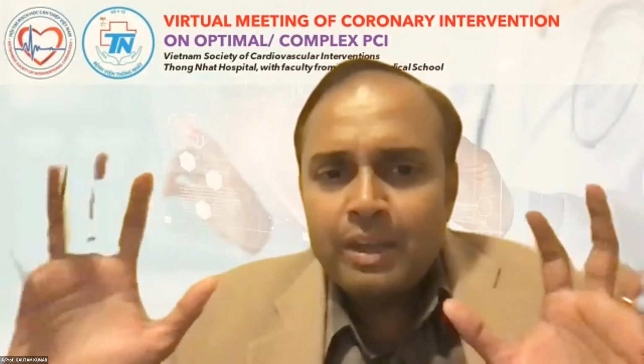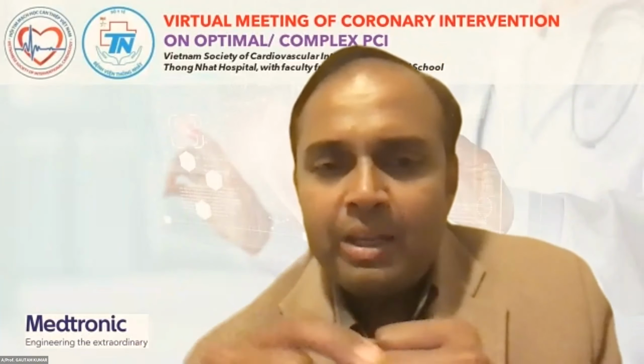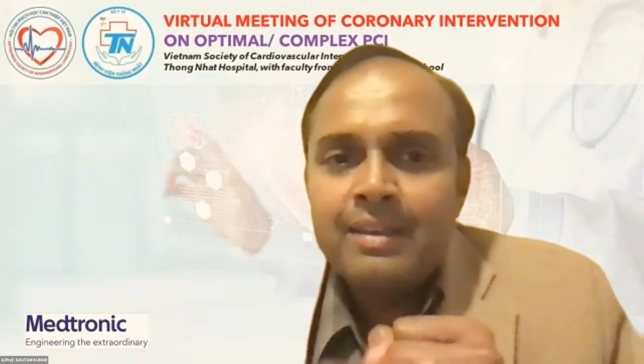And there are multiple things going on in the cath lab. You're working on the CTO, but you have to see: is the ACT being checked? Is the ACT therapeutic? Is the patient sedated? Is the patient moving? Are they preparing for the next step? Are they anticipating the next wire you're asking for? So it is very good to have 2 operators to manage these kinds of cases.